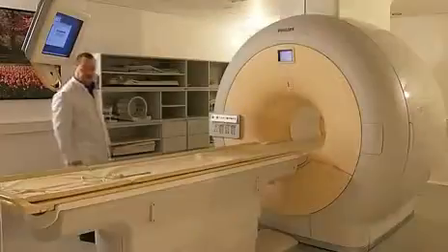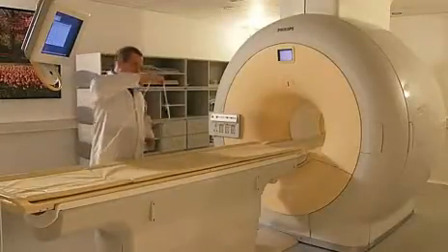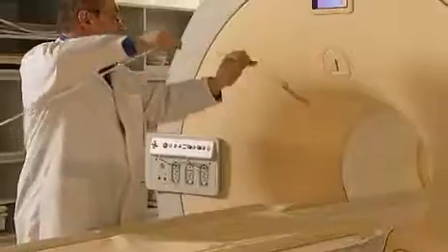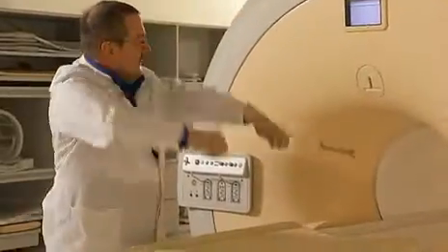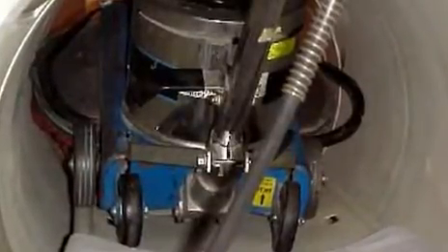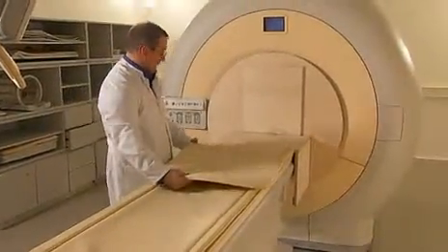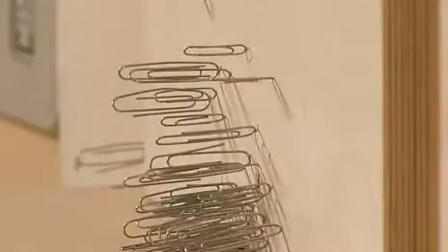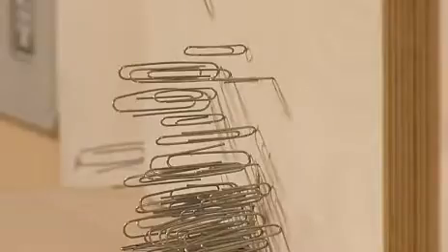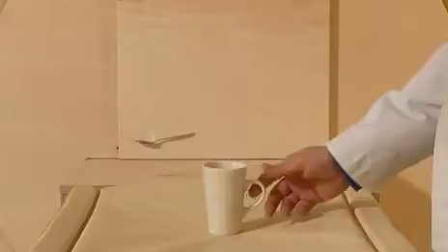Potential hazards. The magnetic field will pull ferromagnetic objects towards the magnet. In this way, a large metal object such as an oxygen tank or cleaning machine can become a missile. Small objects are pulled into the magnet at very high speeds, posing a significant risk. Even a spoon or coins can be dangerous.